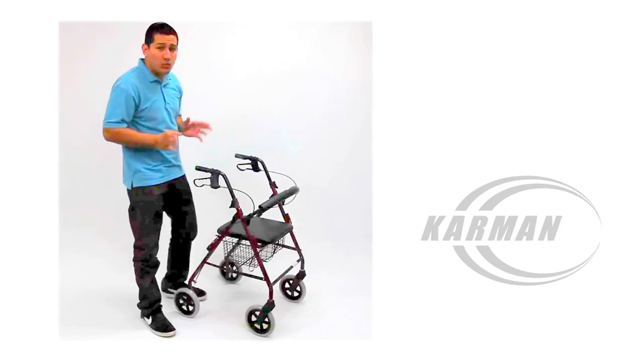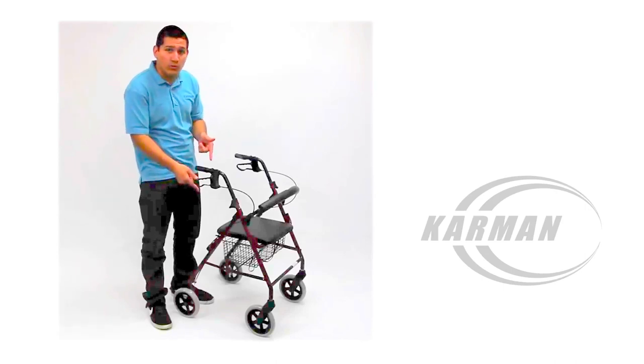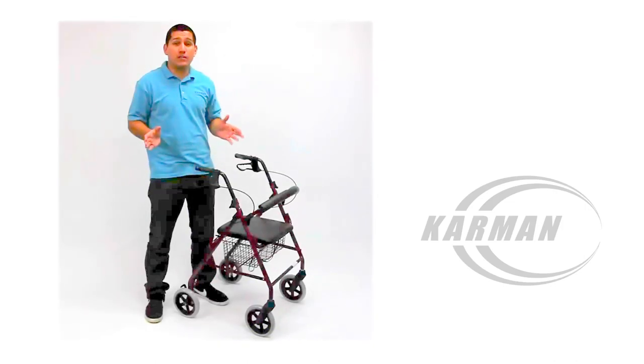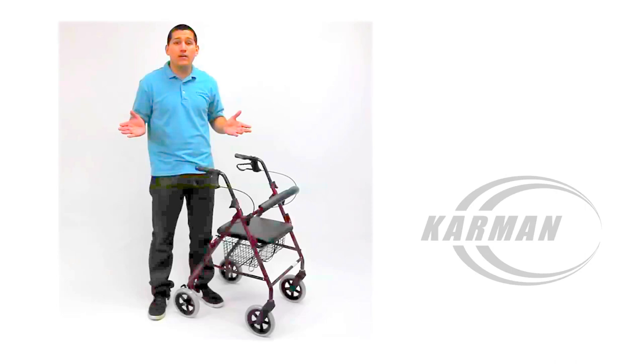What really makes this Rollator special is that it comes with eight-inch casters. These eight-inch casters or wheels are designed for someone who's an outdoor person who loves going out on the streets and curbs, maybe even dirt and grass. This Rollator has larger casters allowing the user to virtually go anywhere and everywhere.